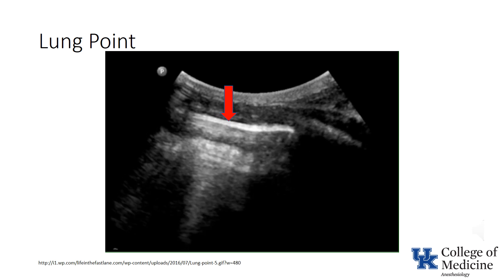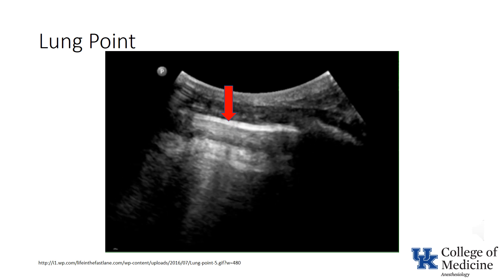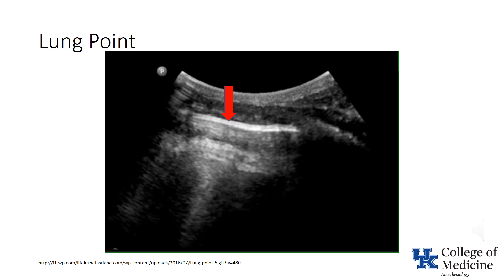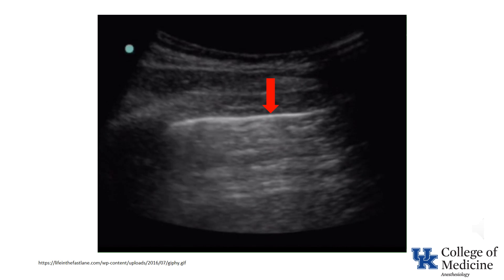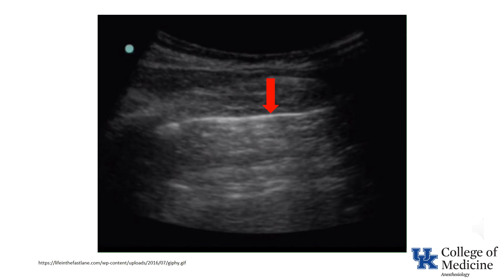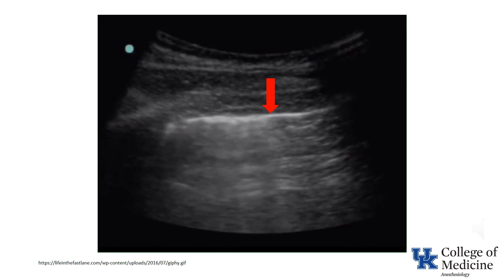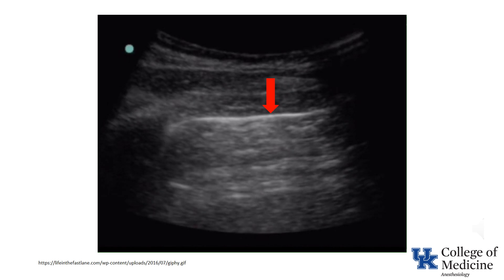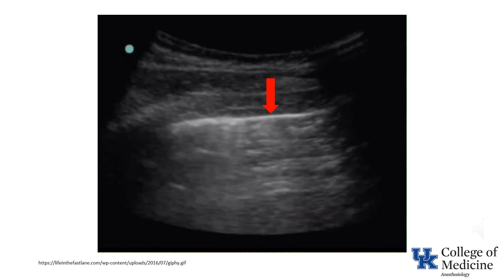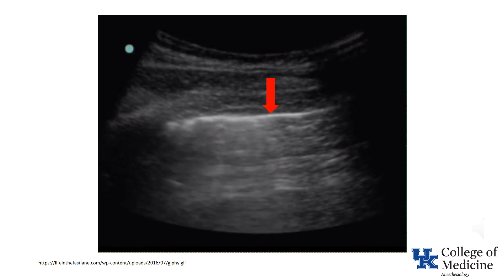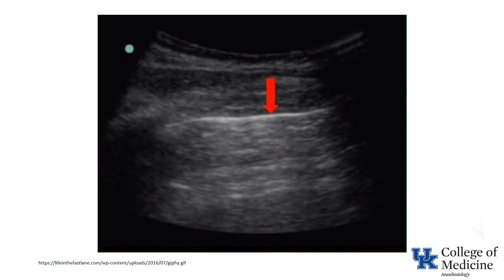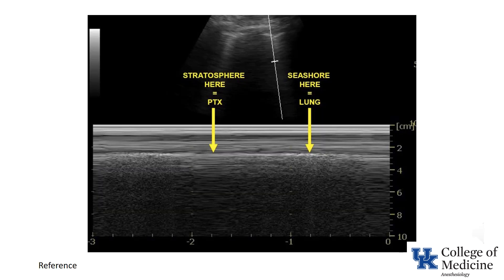This video demonstrates what's termed a lung point. Notice that no lung sliding is present to the left of the red arrow and that lung sliding is sometimes present to the right of the red arrow. A lung point identifies the point at which the visceral and parietal pleura becomes separated in a pneumothorax. When imaged in M-mode, a lung point presents as a seashore sign alternating with a barcode or stratosphere sign. The presence of a lung point is essentially pathognomonic for a pneumothorax.